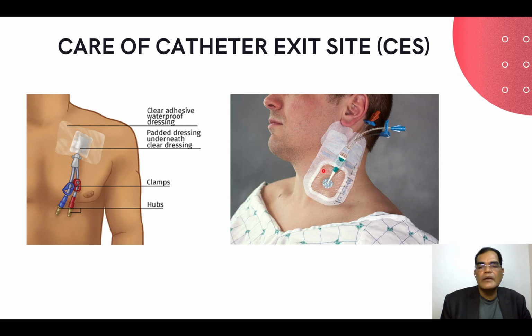And again, to give a little explanation on the straight internal jugular catheter, once it is placed, it will look quite neat like this. So that means this catheter is not having any issues in terms of discharge or infection on the exit site.